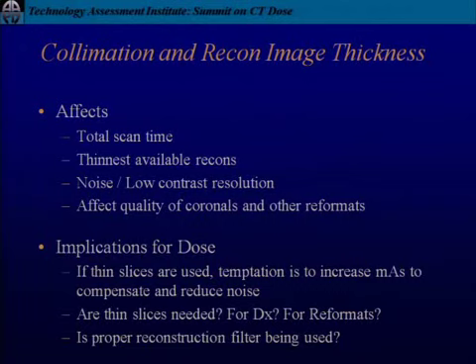And again, the CTDI vol will show it on the scanner. So if you can sit at the scanner and just change the collimation setting, and you notice what the displayed CTDI vol is, if it's displayed, because it's not required to be displayed, but if it's displayed, you'll see it. Okay? Does that help? Yes, thank you.